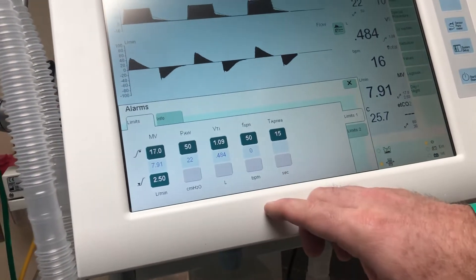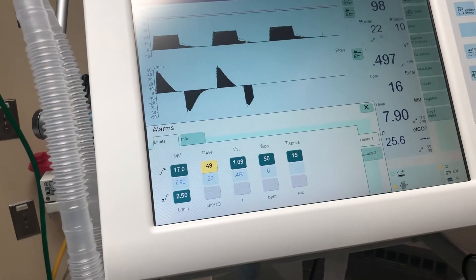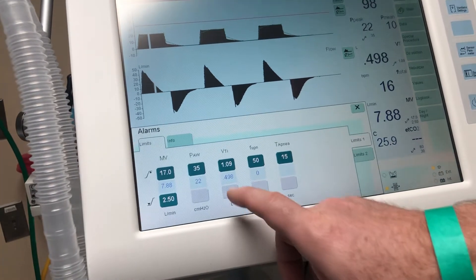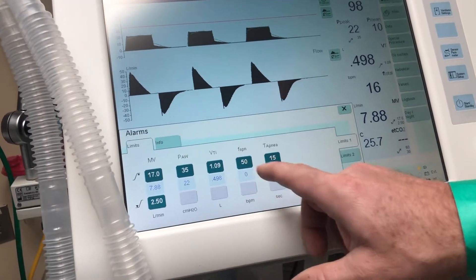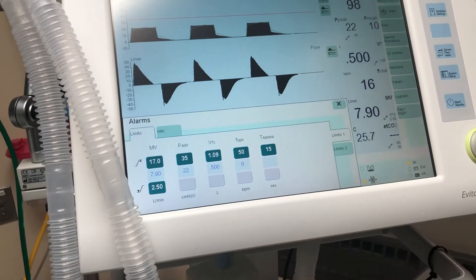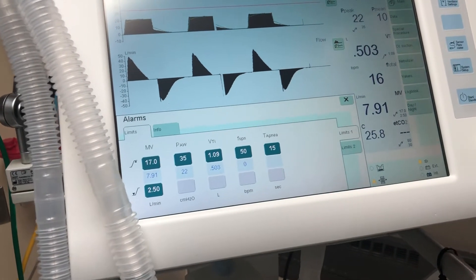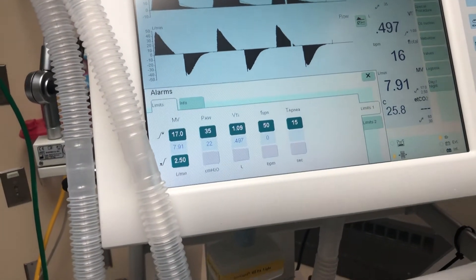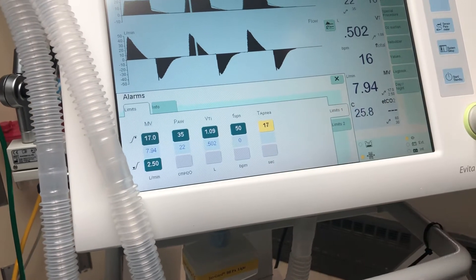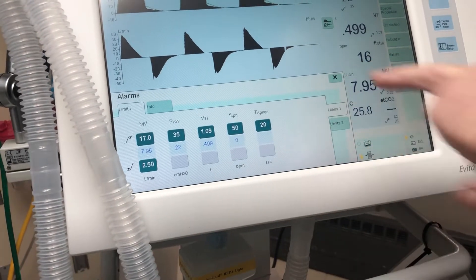Here you have your airway peak pressures — the patient's doing about 22 and we have it set at 50, so we'd like to keep it about 10 above, changing it to about 35. For spontaneous breathing rate, the ventilator is set at 16, but this monitors the patient's own breathing. If you want to alarm when they breathe above 25, set that at 25. Your apnea ventilation is set at 15 — we'll change it to about 20.